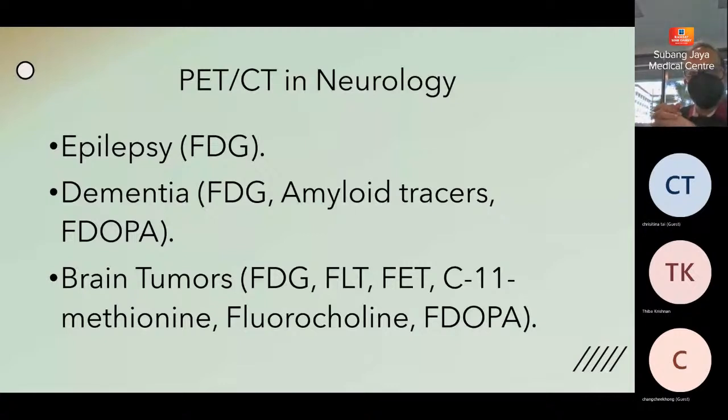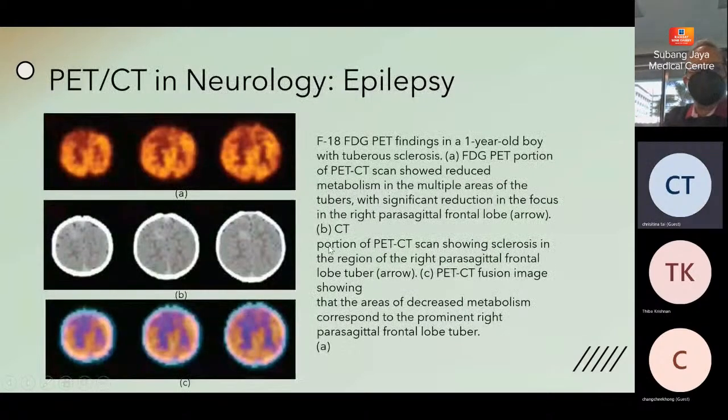And in brain tumors, again, we only have FDG as our main tracer. FDG is not very specific for brain tumors. It can be used in certain situations. I'll discuss it in a short while. So coming back again, this is just a slide to illustrate.